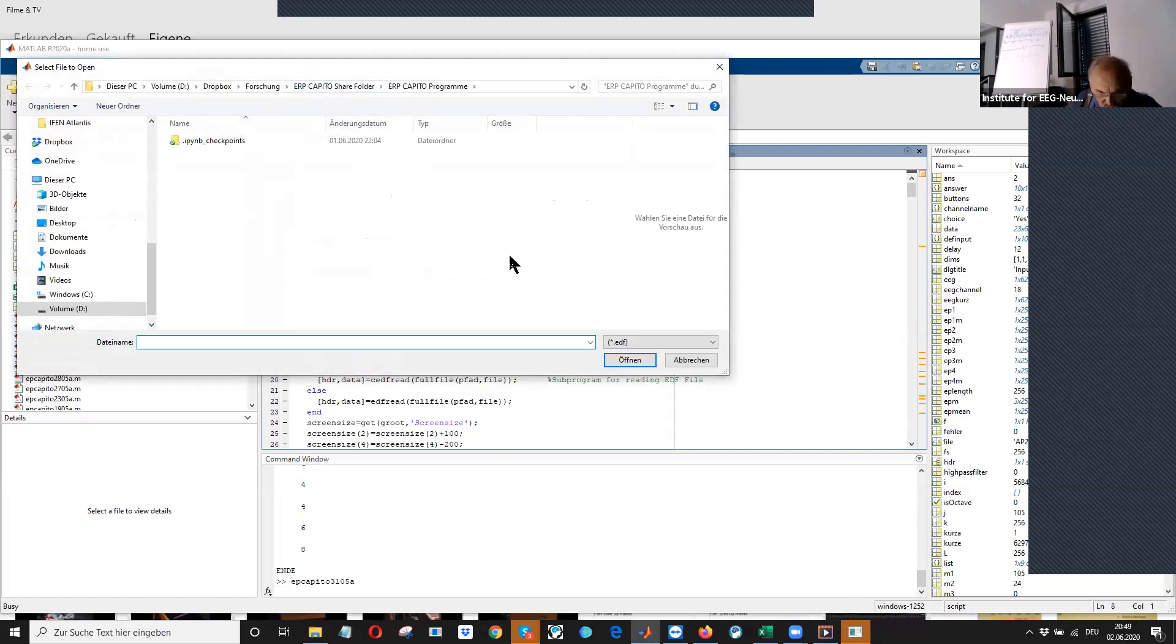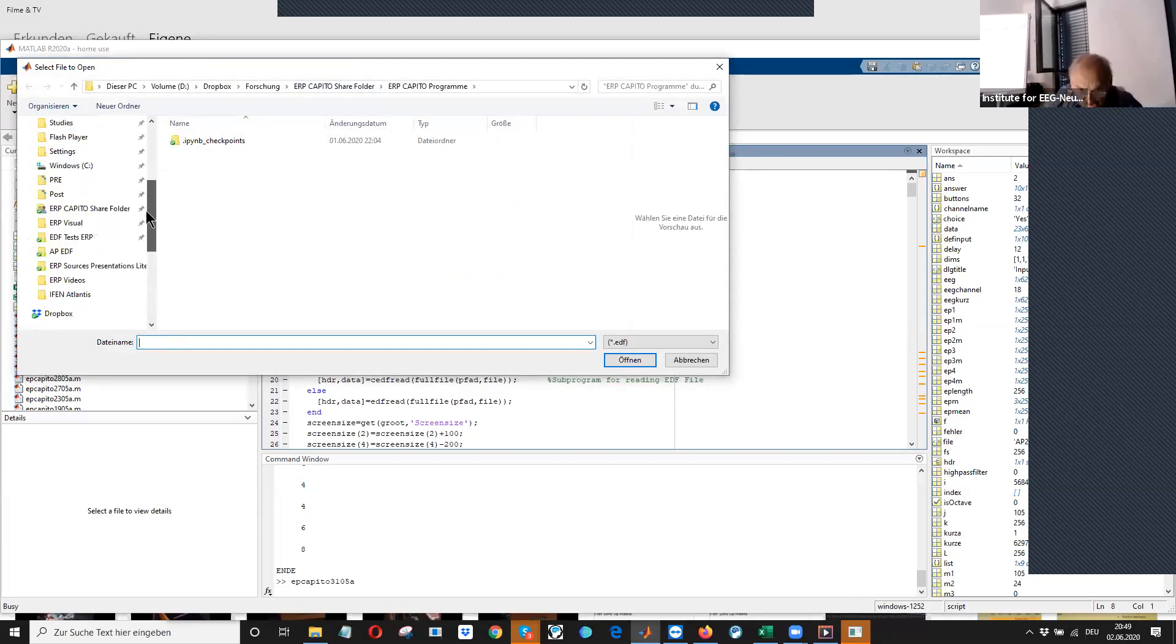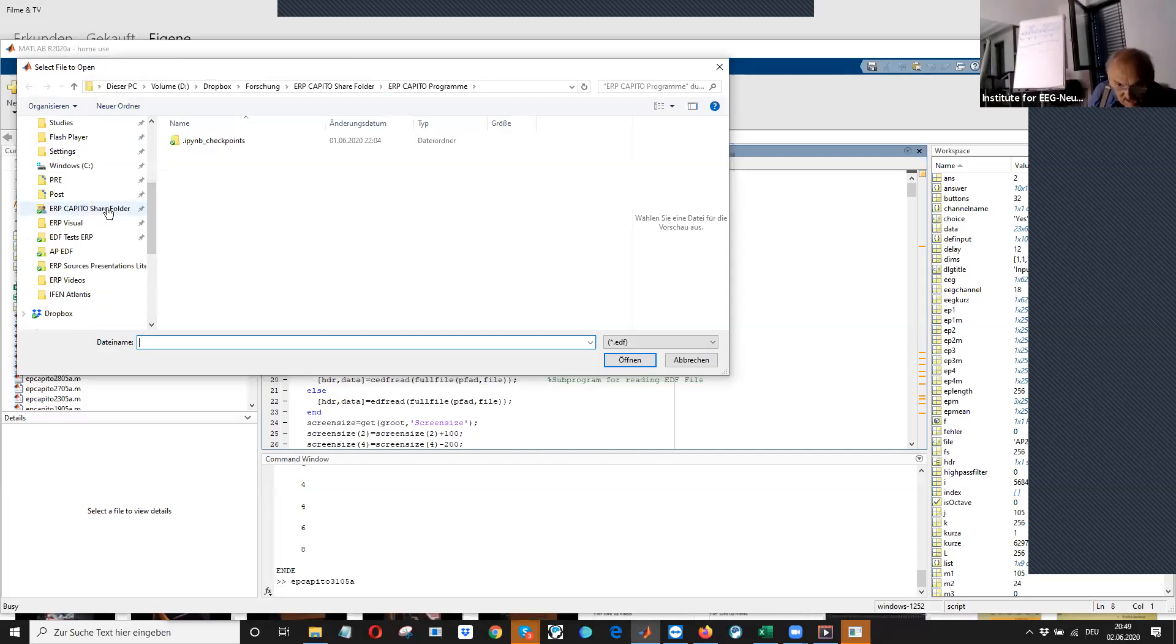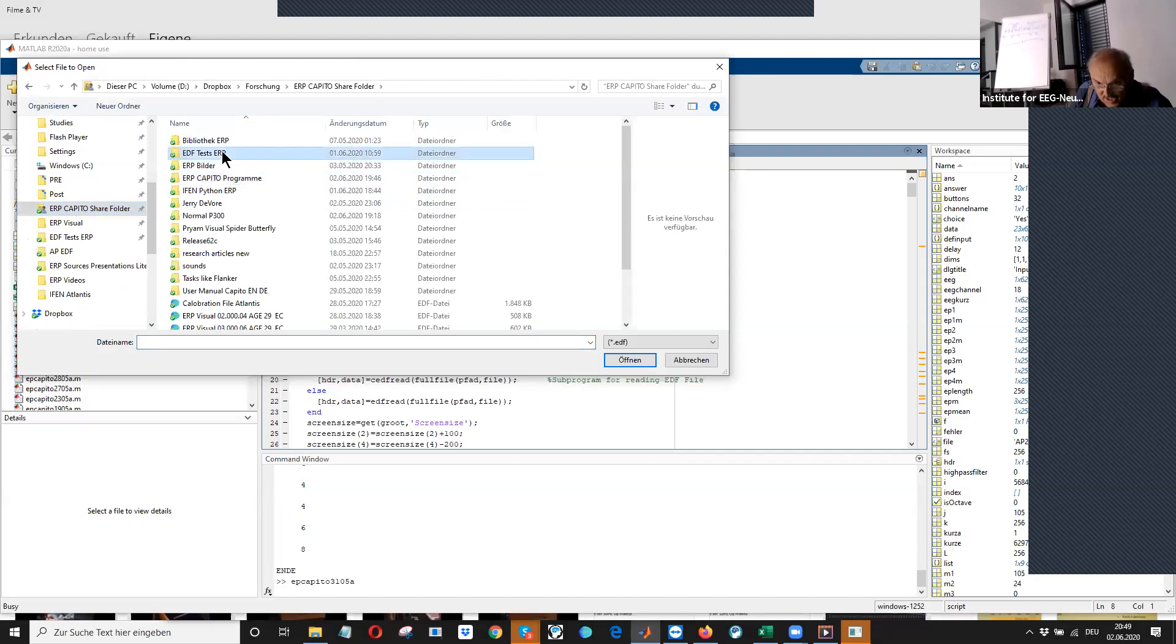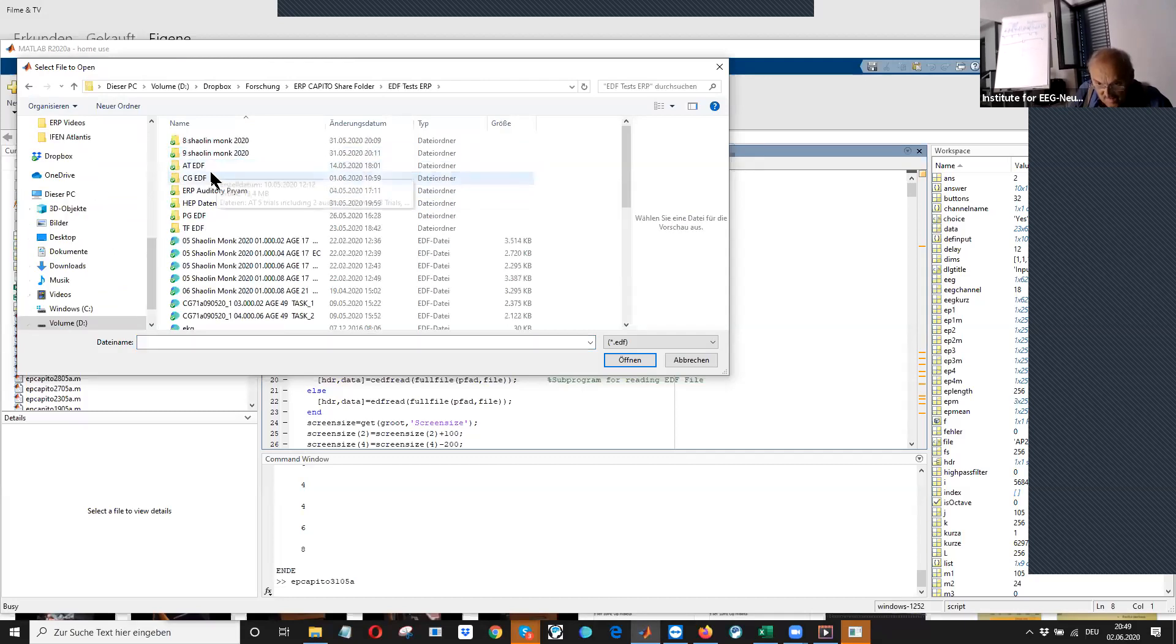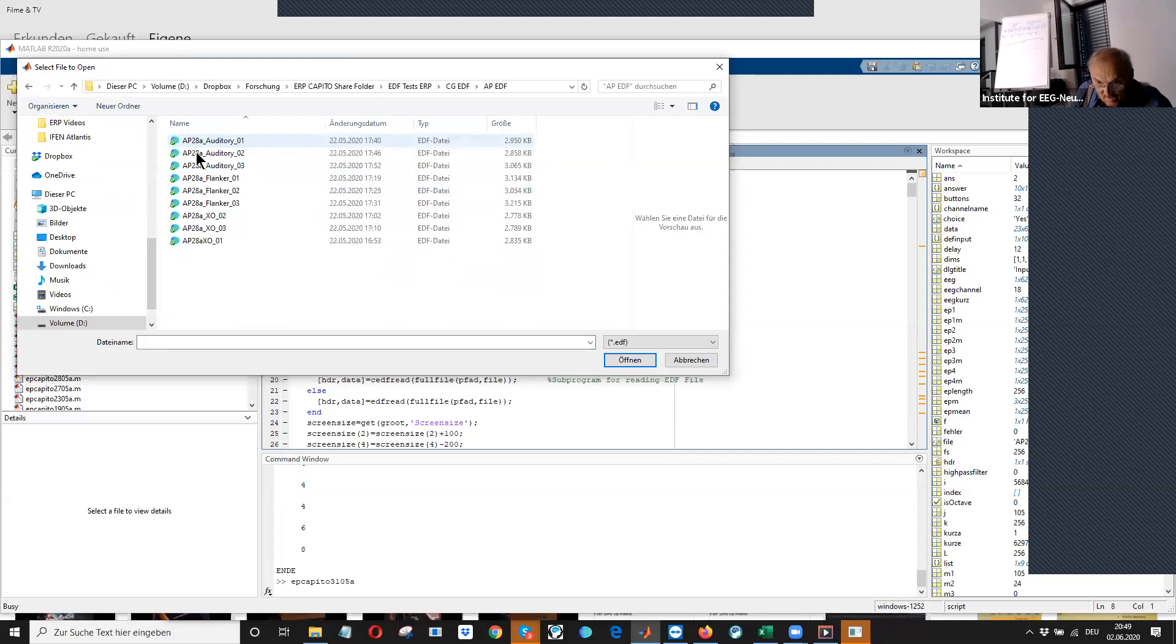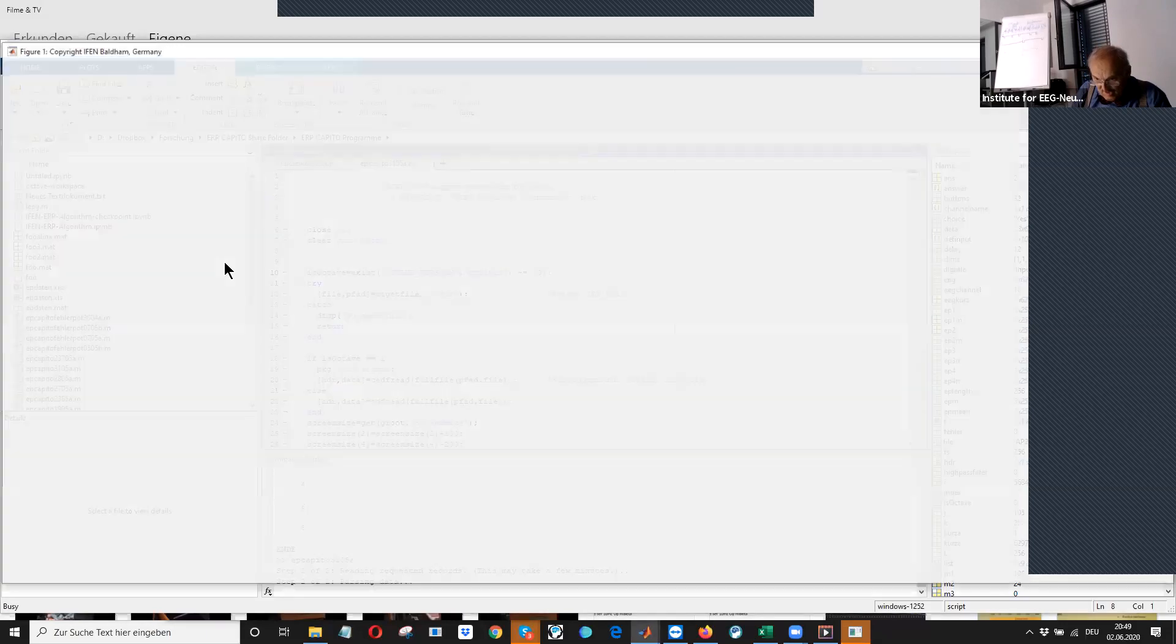I have to find the EEG file. I have one client here. I show you the first XO test. We also did some flanker and auditory tests, but now I show you the first XO test.